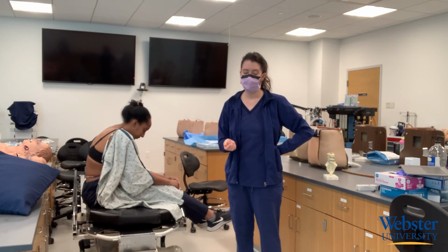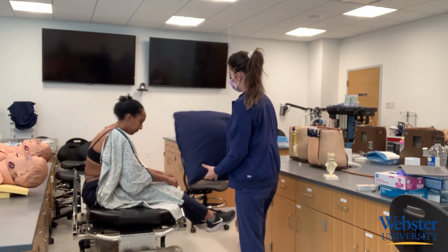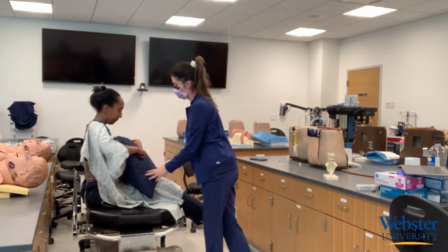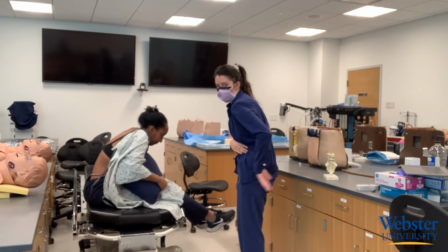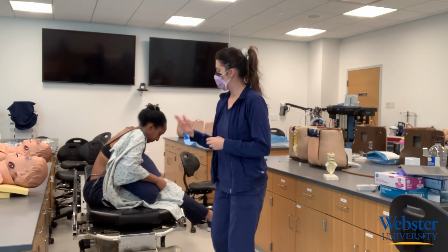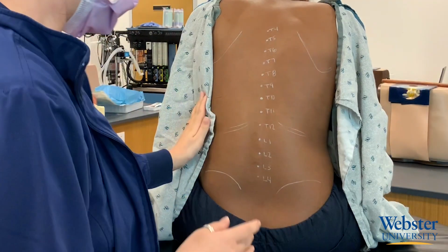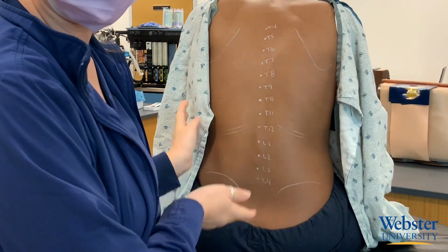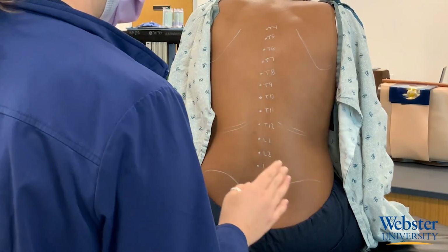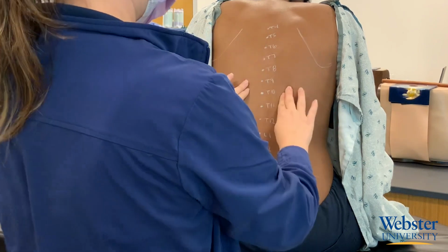Handing the patient a pillow to hold and lean over can help them position better too. Next, you should identify where the epidural will be placed, which is at the L3-4 interspace. When the patient is positioned, it's important to identify where your epidural will be placed. You can use a variety of landmarks to identify this.